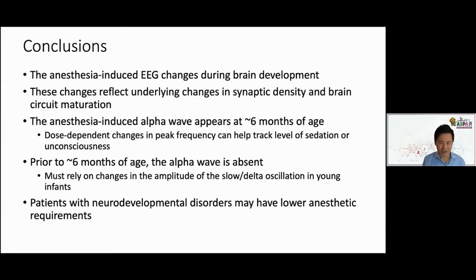of sedation or unconsciousness. And at all times, especially with sicker patients, you're going to want to adjust the scale so you can optimally visualize those slow and alpha oscillations. And in particular, sick children, but also patients with neurodevelopmental disorders, may actually have lower anesthetic requirements.